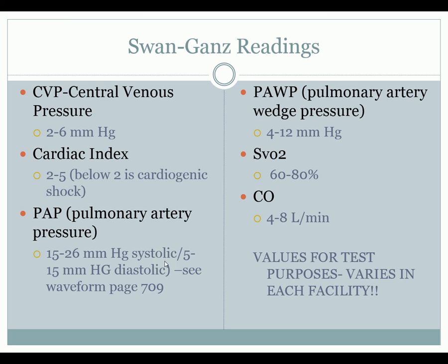There are problems that can occur with any kind of pulmonary arterial catheter. If you don't get a waveform at all, you look up there and all of a sudden it's gone blank, then you want to make sure you're checking all your connections, that a tube's not kinked, that the stopcock's not off, that you don't have some type of clot that's occluded. You can also have what's called over-dampening, where it gets real small, and that's usually because the catheter position may be kinked or clotted. Inability to wedge the catheter, the balloon could have ruptured.